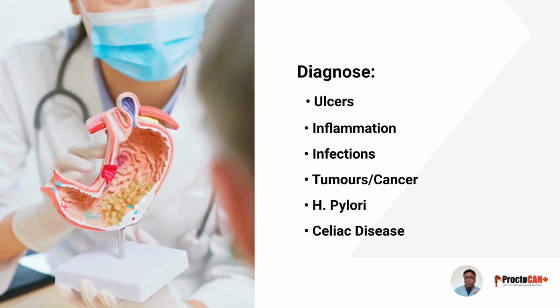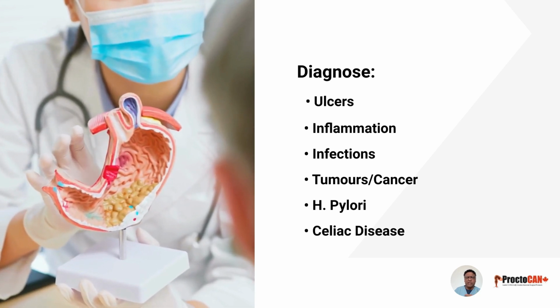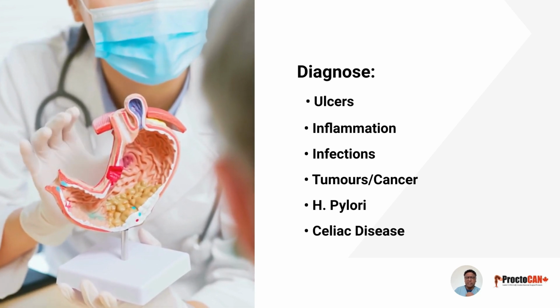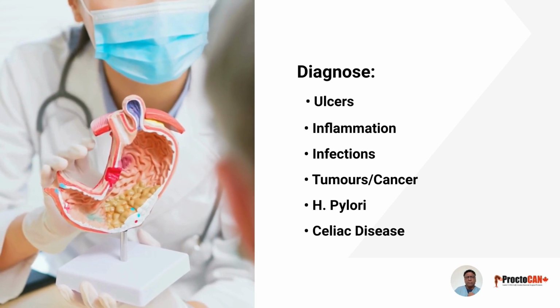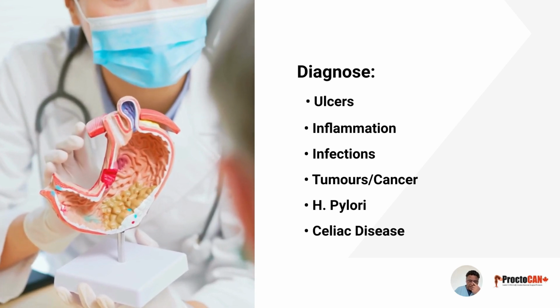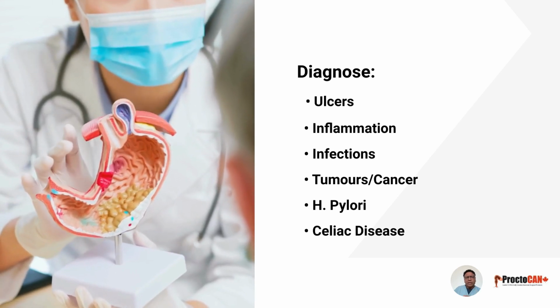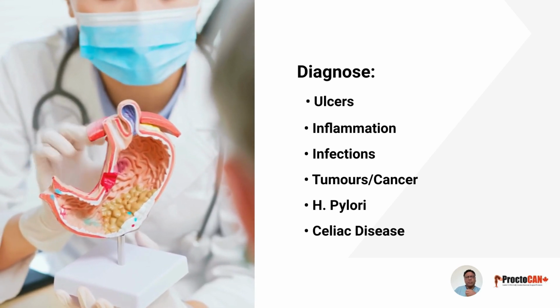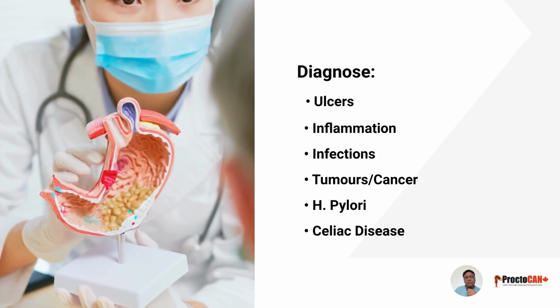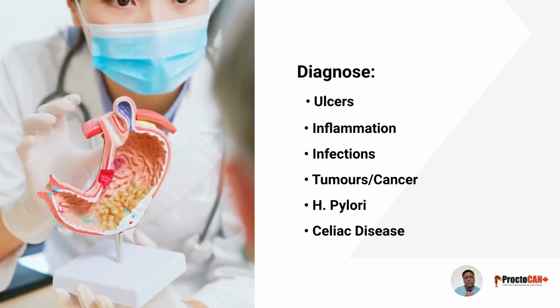In some cases, we may take small tissue samples called biopsies to check for infections like H. pylori, celiac disease, or other causes of inflammation. These biopsies are sent for examination by a pathologist later. The results will be available in about a few weeks. If there is something concerning, we will contact you. A copy of the results will be forwarded to your family doctor. Next time you see your doctor, confirm that the polyps or samples are of no immediate concern.